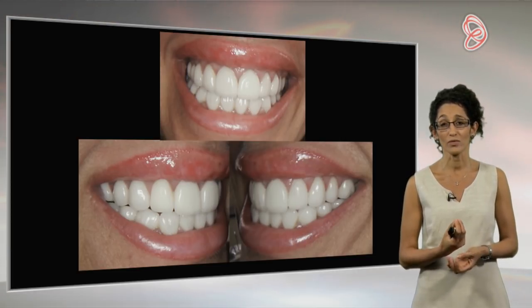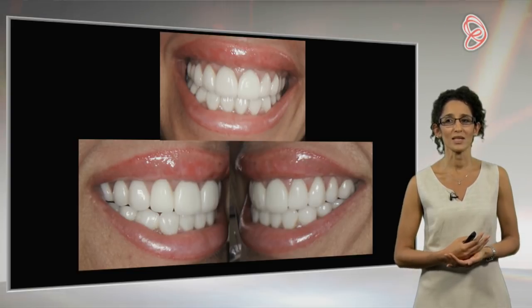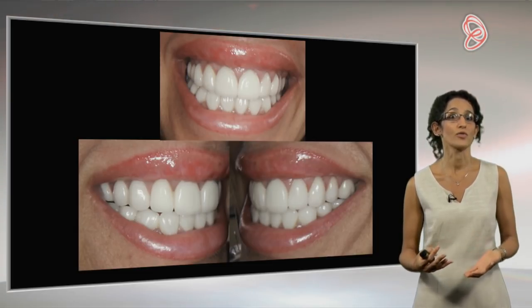So I think it's actually very good to use that, because also you can see we've done it flaplessly and there's no redness on the tissues, there's no inflammation. So I know that those gums have really been behaving for over a year now.